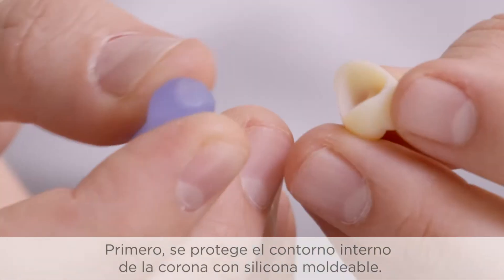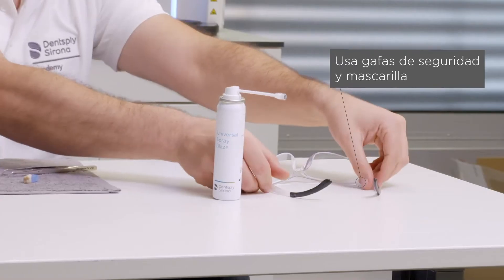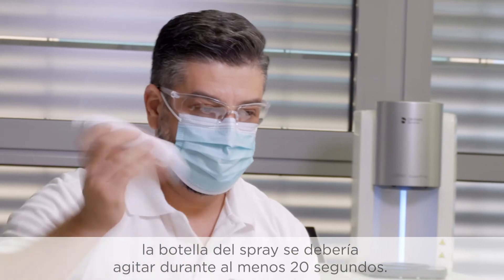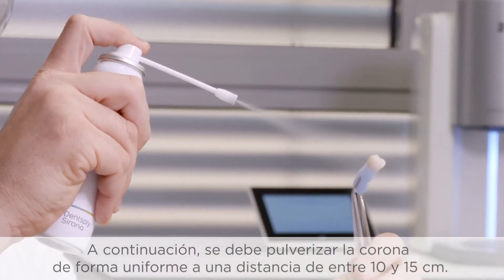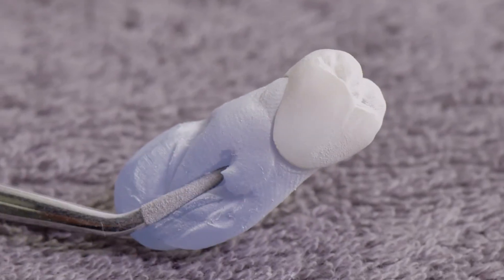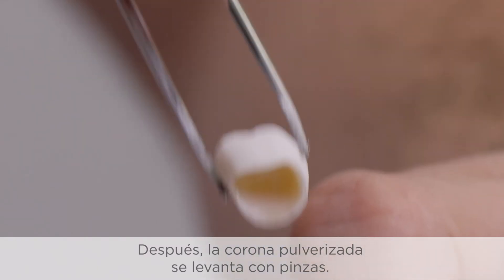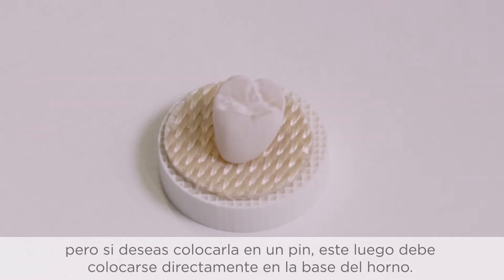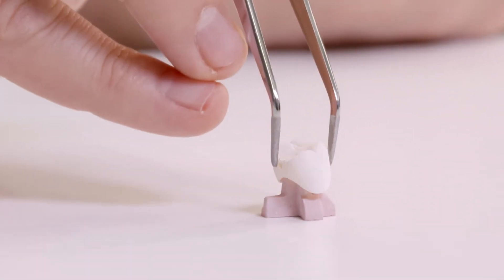First, the inner contour of the crown is protected with a moldable silicone. For the best distribution and a homogenous spray result, the spray bottle should be shaken for at least 20 seconds. Then the crown should be sprayed evenly from a distance of 10 to 15 centimeters. The sprayed crown is now lifted off with tweezers. Either a firing fleece can be used to place the crown on the firing tray, or if you would like to place the object on an investment pin, it is placed directly on the firing base of the furnace.